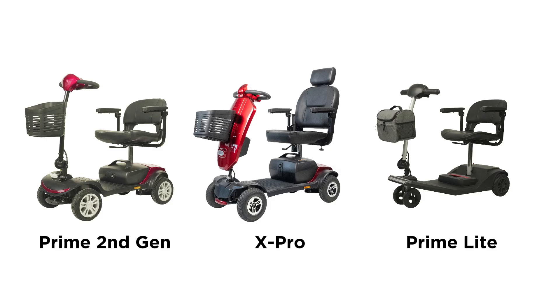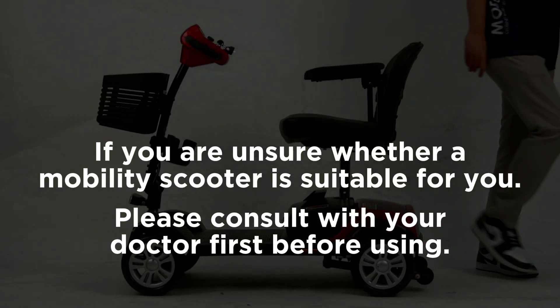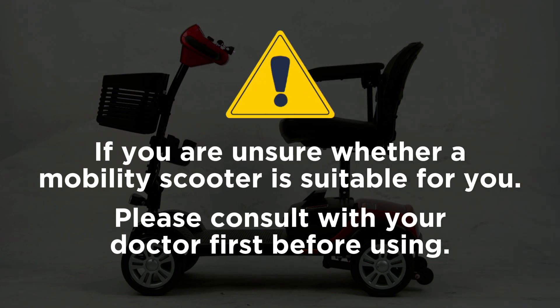This is the tutorial for the Flexi Prime Max 2nd Gen Mobility Scooter. This tutorial is also applicable for the Flexi Prime 2nd Gen X-Pro as well as Prime Lite. Before I start this video, if you are unsure whether a mobility scooter is suitable for you, please consult with your doctor first.